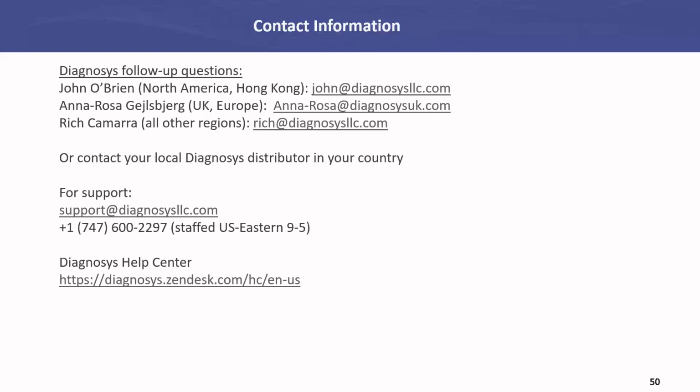Very good. The next question relates to the flash stimuli range, specifically in white 6500K, but maybe we can broaden that and talk about the range across a couple of our stimulators: bright, standard, dim. We have 3 different stimulators, and each of them has a range of 9 orders of magnitude. The difference between them is where the center is. The dim stimulators start at about 10 to the -9th and go up to about 0.1, 1, something like that.